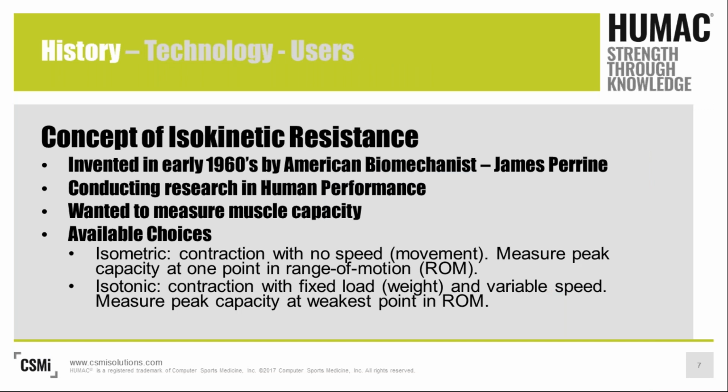And that's the history of what we're going on with. So Isokinetic Exercise was really first developed more than 50 years ago. A lot of the credit is given to Helen Hislop and James Perrine for its introduction. They had an early paper called the Isokinetic Concepts of Exercise, and they described in it all of the early physical parameters that can be analyzed, including force, work, power, and endurance. And quite honestly, those parameters still mark some of the most important components that we can test for.